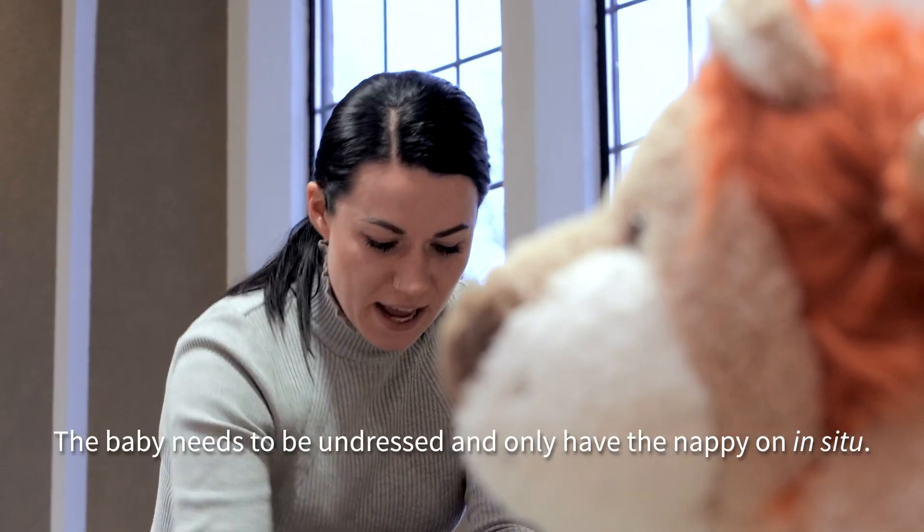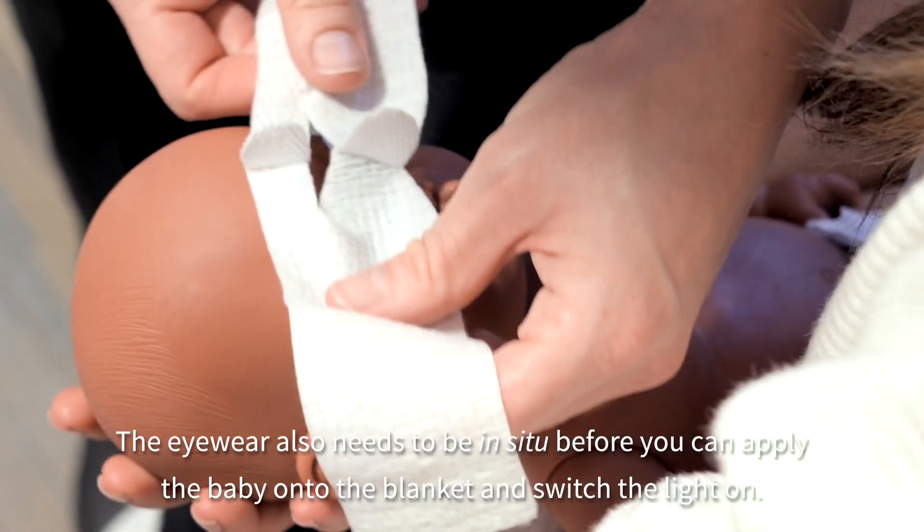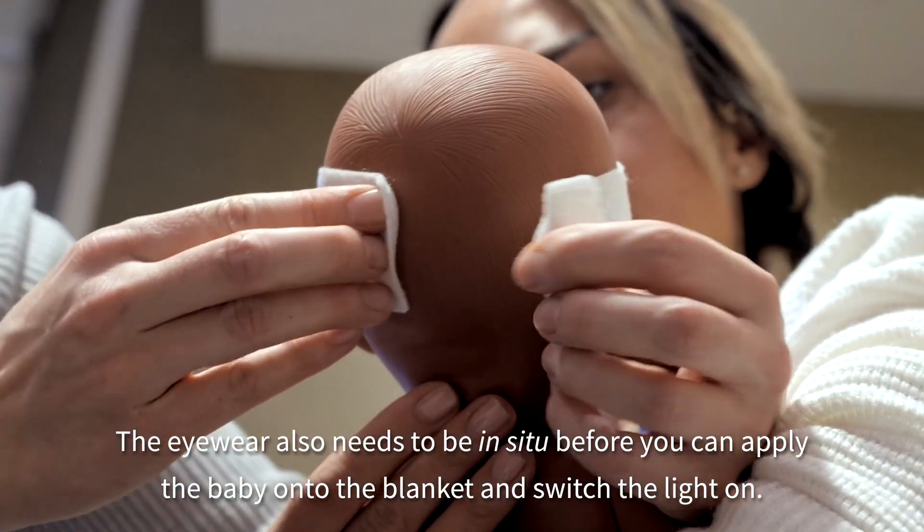The baby needs to be undressed and only have the nappy on. The eyewear also needs to be in situ before you can apply the baby onto the blanket and switch the light on.